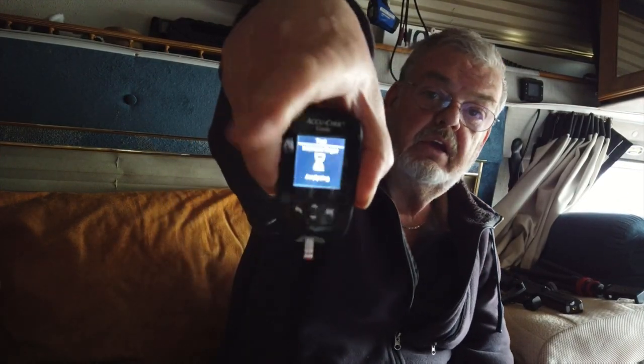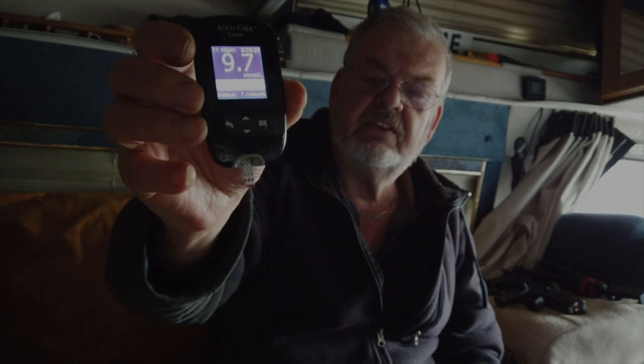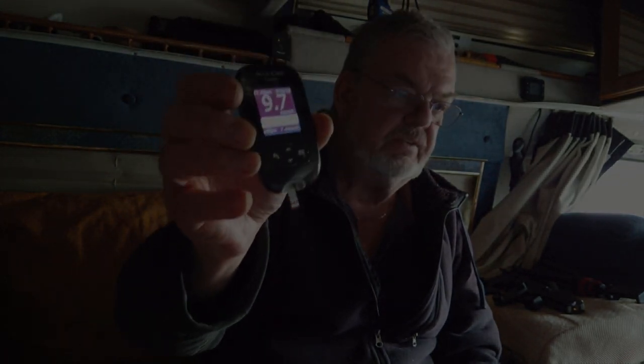Okay guys, time for the afternoon — two hours after breakfast reading. A little blood. The reading is 9.7. Anywhere between 7 and 11.5 or 11.7-something is normal — beautiful, perfect. My blood sugar count is good. Thank you Lord, thank you Jesus.